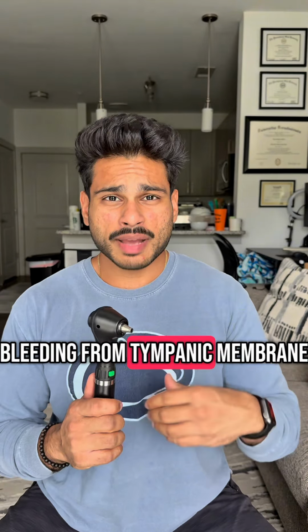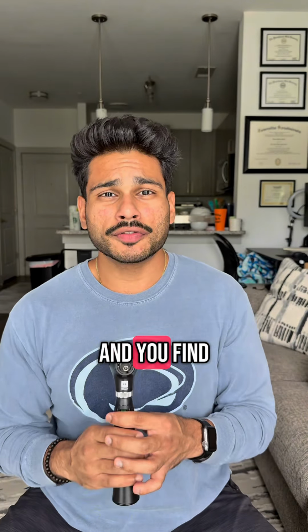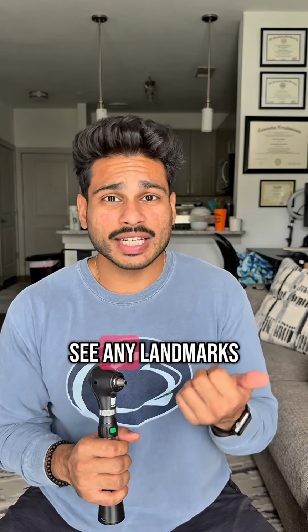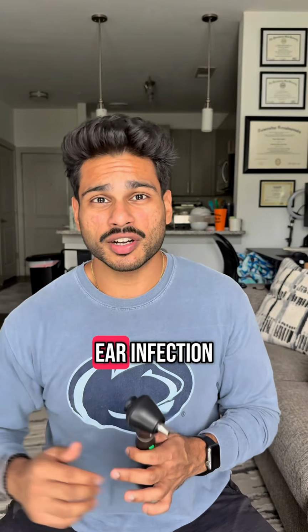If there's bleeding from the tympanic membrane and the tympanic membrane looks damaged, then it's possible that it's a tympanic membrane rupture. If you do an otoscopic exam and you find the canal is swollen, the tympanic membrane is angry, and you cannot see any landmarks on the tympanic membrane, then you can also consider outer ear infection as well as middle ear infection.